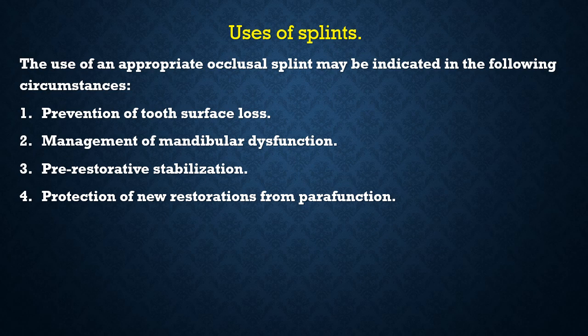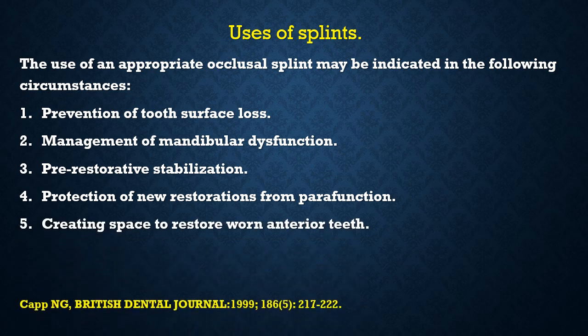And fourth, protection of a new restoration from parafunction. Even if you do restoration for the worn teeth, it is advisable for those patients to wear a post-restorative splint to protect the new restoration from damage. And the last is creating space for the worn anterior teeth.